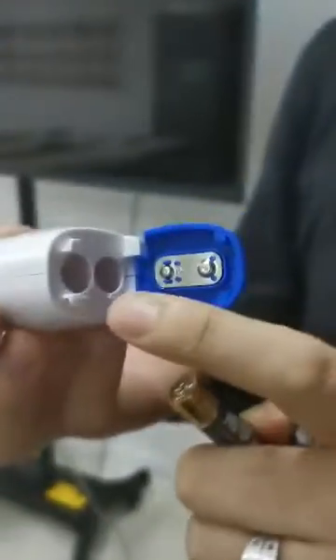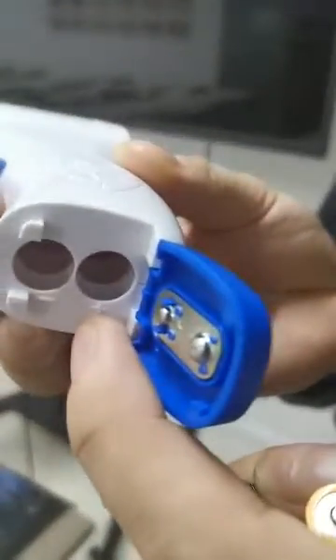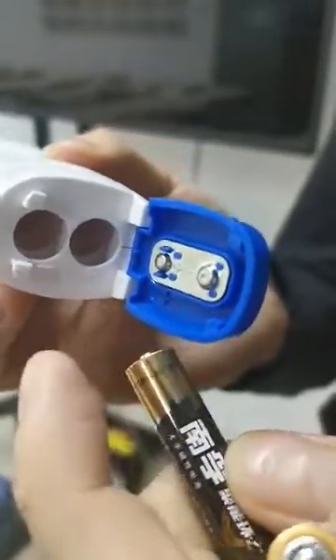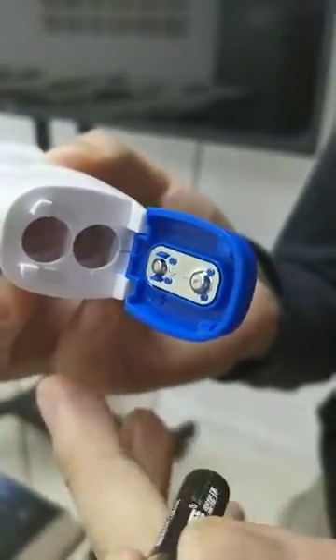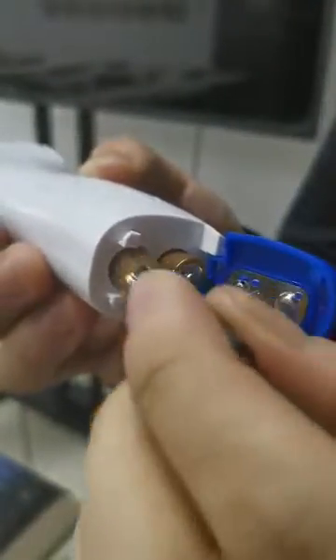The thermometer has two holes — one is negative and the other one is positive. We should install the batteries correctly. This one is the positive one, so I install it like this, and the negative one, I install it like this.